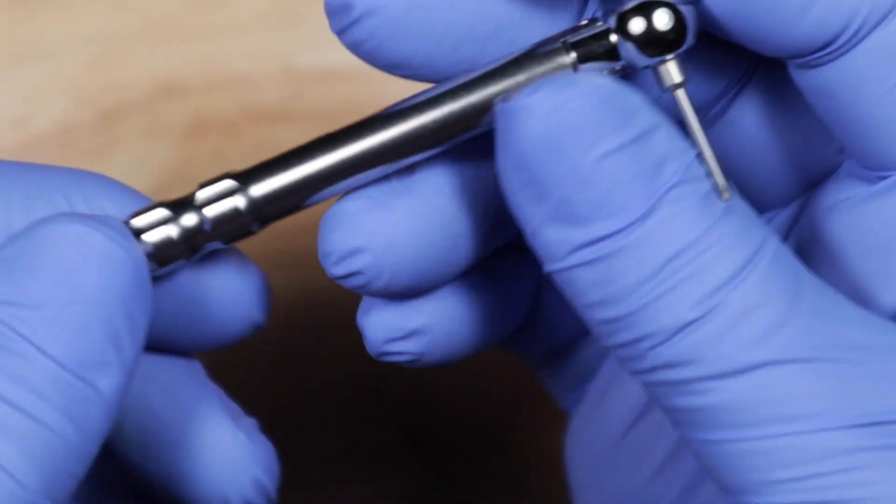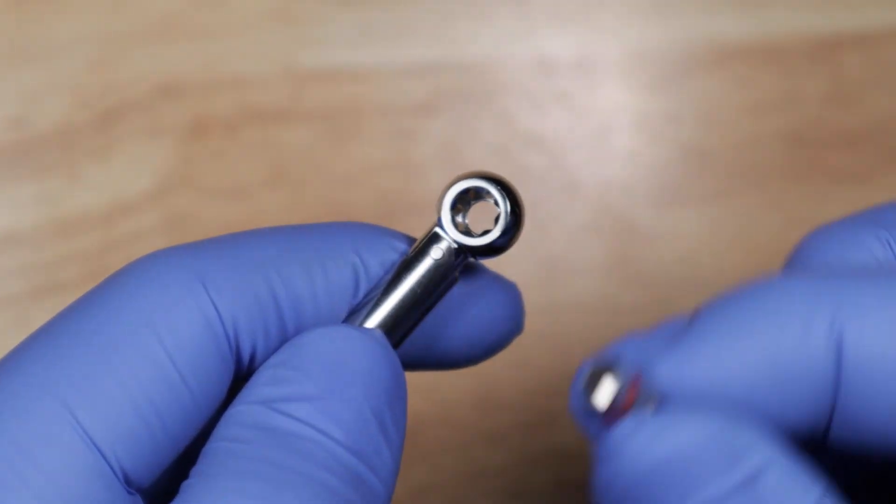That's about it though. This is the single setting torque wrench. Remember it's square right here. It takes a square bit.